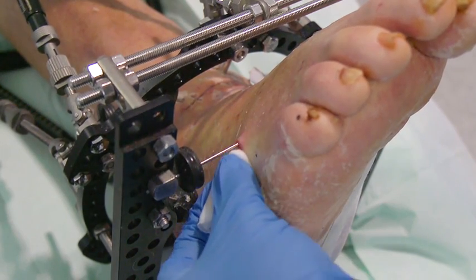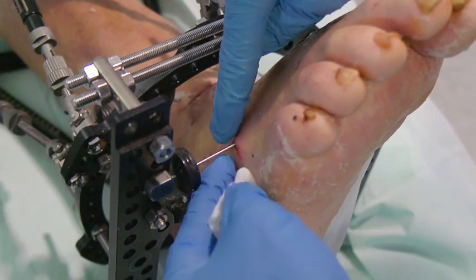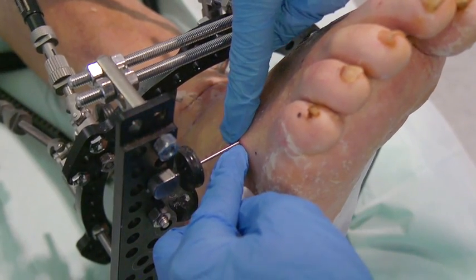It's also a good idea to gently push the skin down towards the limb to make sure it doesn't stick to the wire.